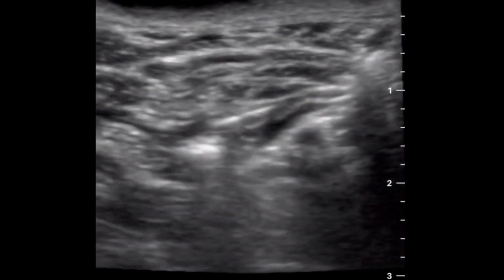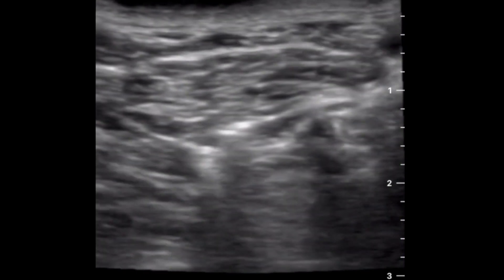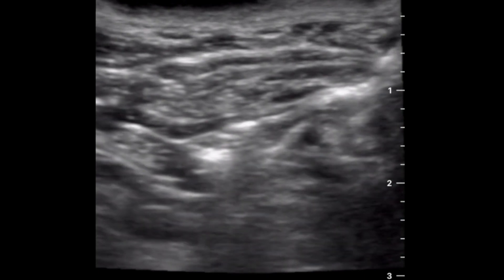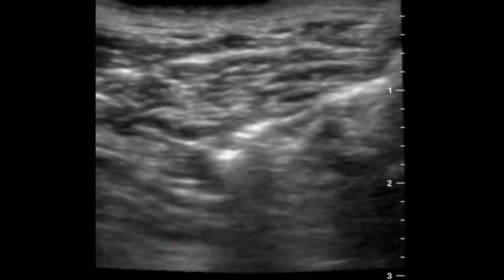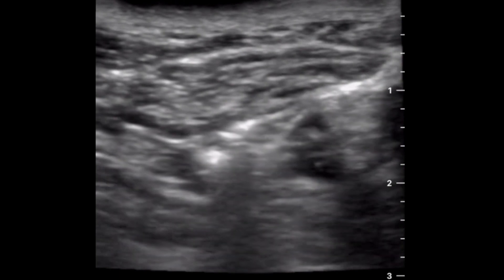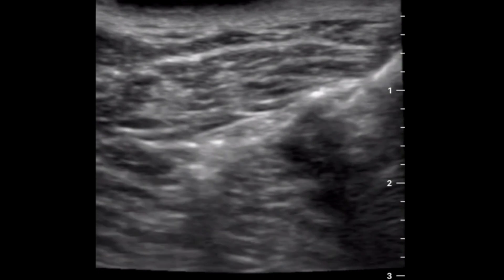I'm going towards C5, there's a pre-fascial injection there — kind of deliberate but not deliberate. You can see C5 delineated, there's the needle tip. We're going to start to put the first batch of local in there — it goes, covering C5, dropping down. Then I'm moving the needle in between C5 and C6, and we get some drift of local beneath that, separating C5 and C6 out, with anterior drift of the local as well. Pretty good block.